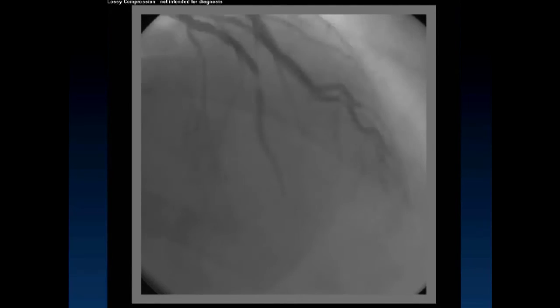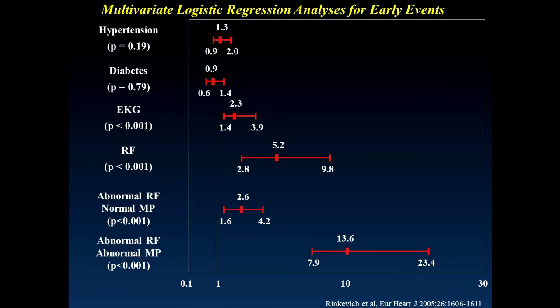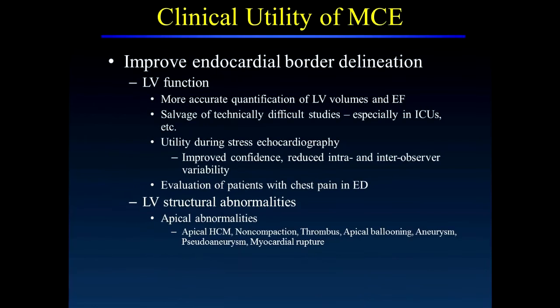The patient was therefore referred for coronary angiography. This revealed that the patient indeed had a very critical stenosis in the mid-left anterior descending coronary artery with slow flow distally. He had successful angioplasty of the lesion and was discharged home the next day.